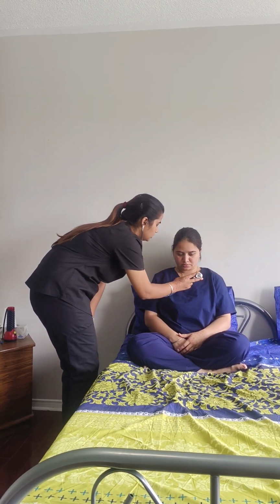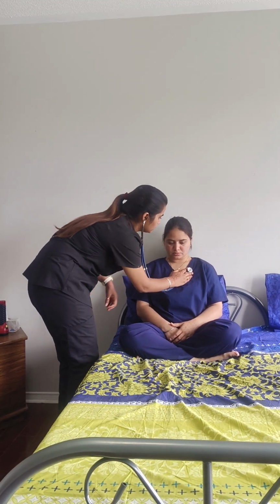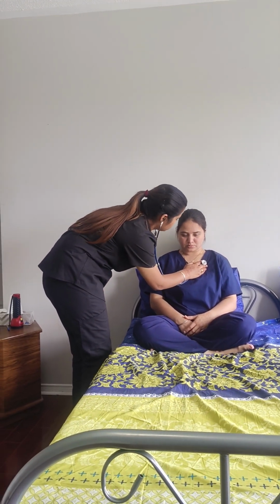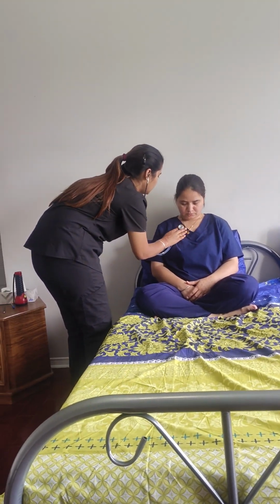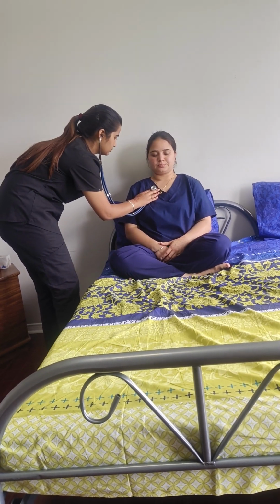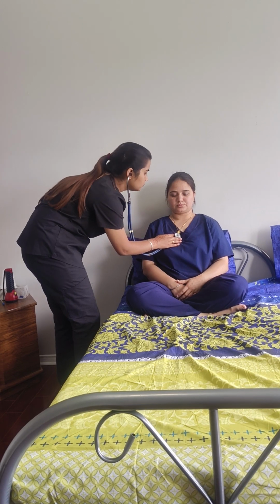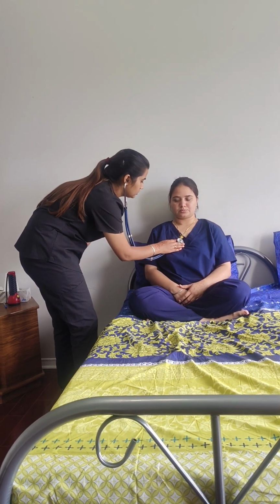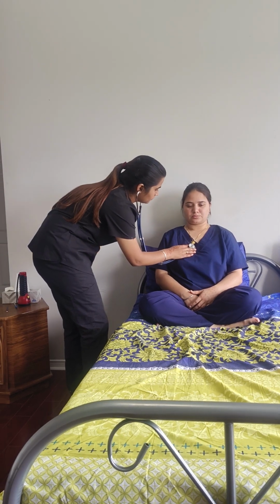Now at the second intercostal space to hear the upper left lobe of the lung. Similar to the right side. Now at the fourth intercostal space, I am going to hear the middle lobe of the right lung. Now the left side.